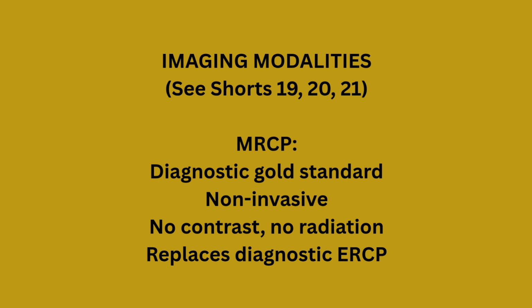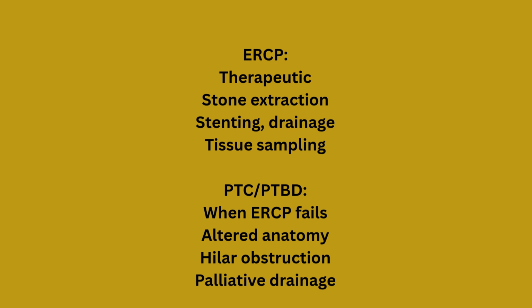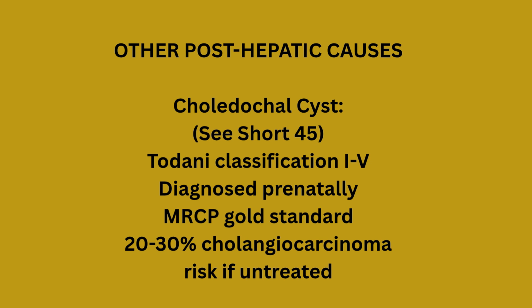Imaging modalities. MRCP is the diagnostic gold standard for biliary imaging. Non-invasive, no contrast, no radiation. Replaces diagnostic ERCP completely. ERCP is now primarily therapeutic: stone extraction, stenting, drainage, and tissue sampling. PTC and PTBD when ERCP fails or anatomy is altered. For details, see Short 19, 20, and 21.